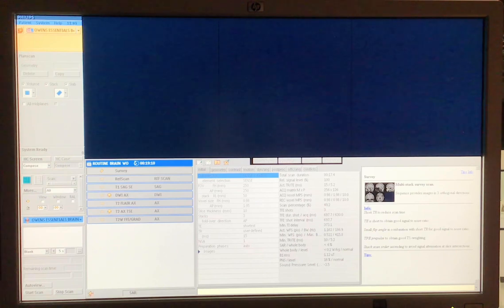Mary Jo. I'm going to say, Mary Jo, are you doing okay in there? It's just going to take me about a minute here to get things set up, and then we're going to start with our first picture. This way, your patients know that you are right here all the time. And it kind of gives you a sense of how your patient is doing in there. Are they nervous? Are they scared? Talking to your patient right off the bat will ease their anxiety, okay?